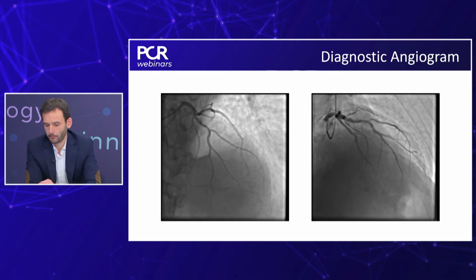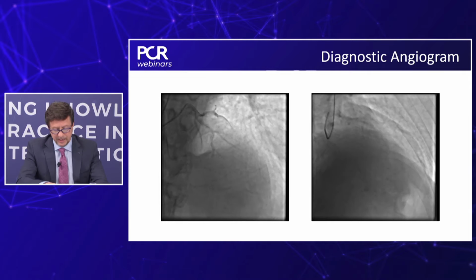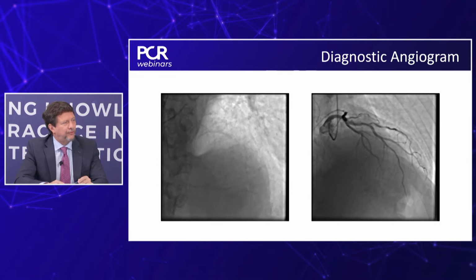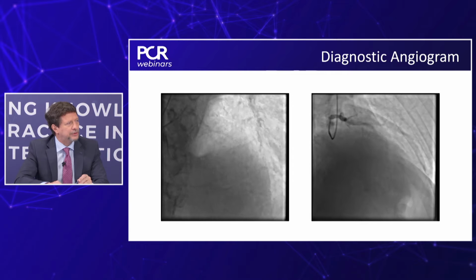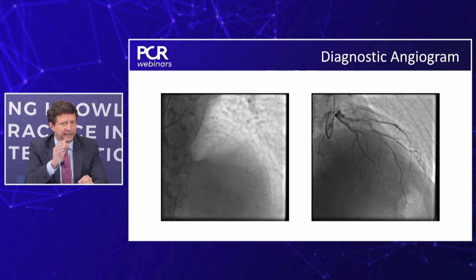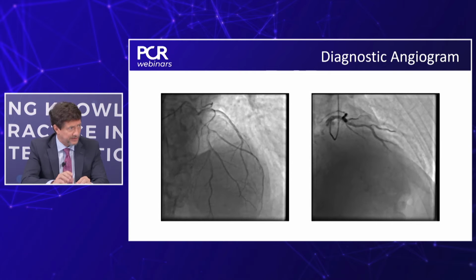Okay, you are raising some interesting questions in this first angiogram. What you said lately, I mean, using a low frame rate for filming calcified lesions is not a good idea. Is that what you mean? You need to have more frames per second to get a better evaluation of the severity of the calcification. Is that right? Is that what you mean?